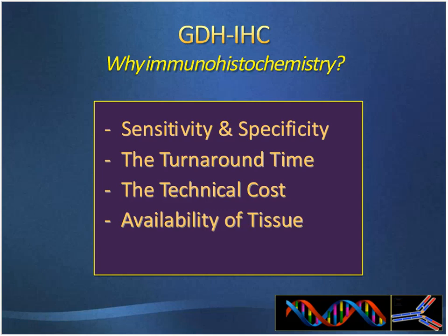It's not specific for specific tumors as we always thought. Therefore, the protein product also. So immunohistochemistry with these antibodies is almost as sensitive and specific as the molecular technique. Not always, but sometimes it is as sensitive, but definitely as specific.